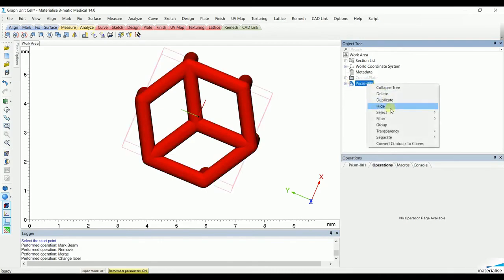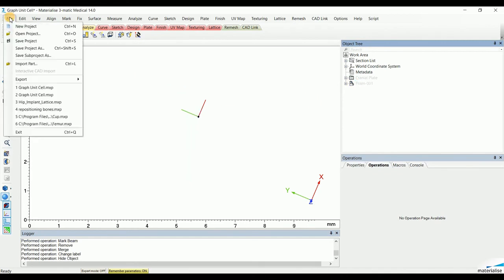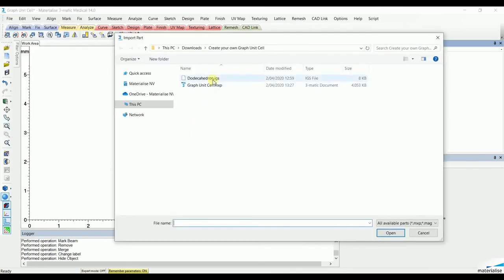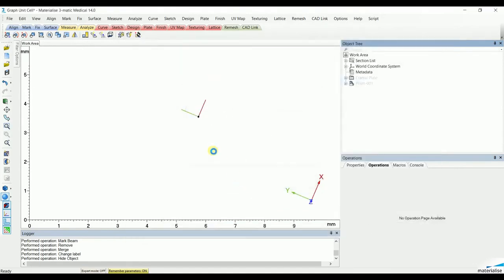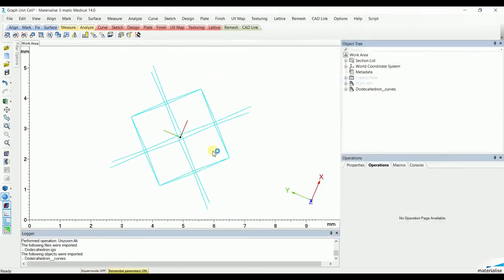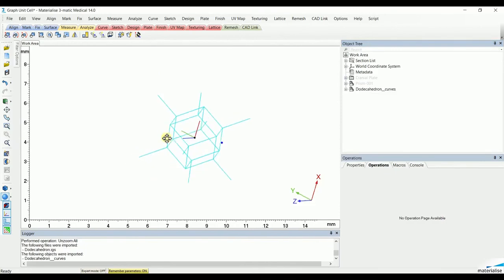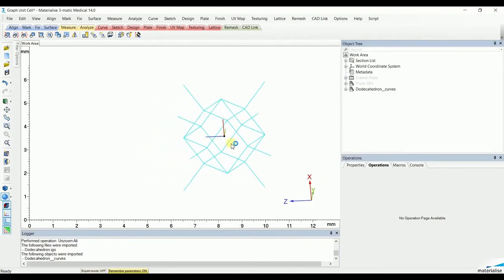A second method is to import an IGES file that already contains the curves that create the skeleton of the graph unit cell. In this case, a dodecahedron. You can already see that the curves are created, and this can be done, for example, in another type of CAD software.